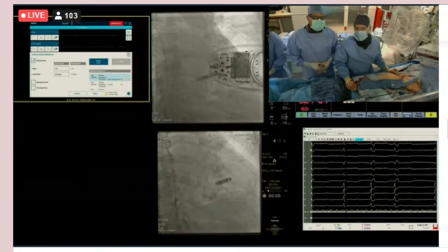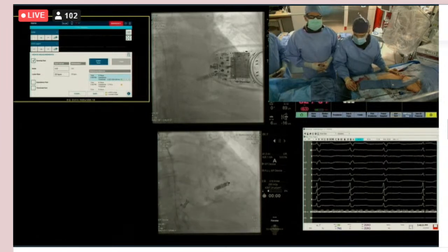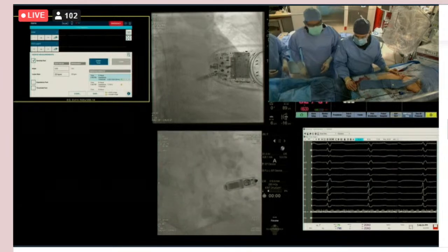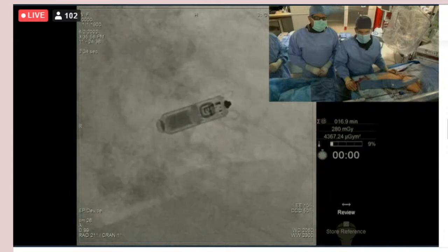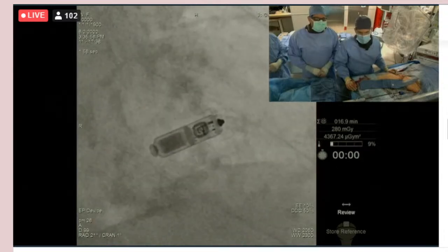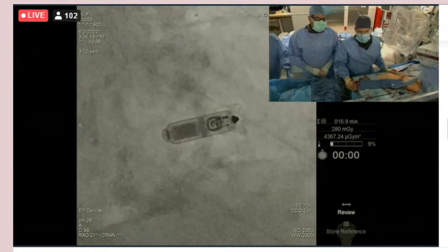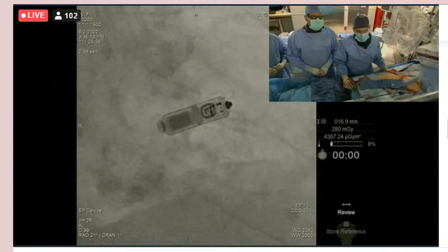Yeah. So we've got a good tug test result here. Do you want me to do it again with a mag? Yeah, or a different angle mag maybe would be good. I'm not going to do it over there. It's magged up right there. Yeah. Can you see it? Yeah, we can see it great now. I think the 2 top ones are good, actually, and the bottom one, sure. Yeah, that actually looks really good. All right. So we got a nice tug result.